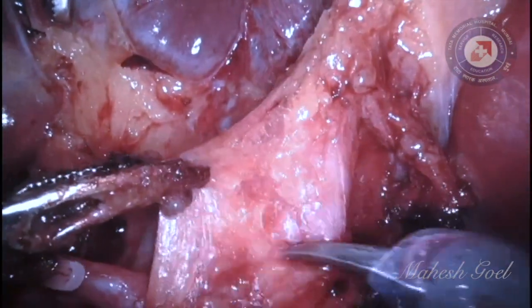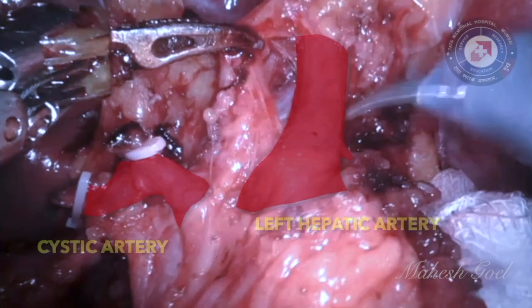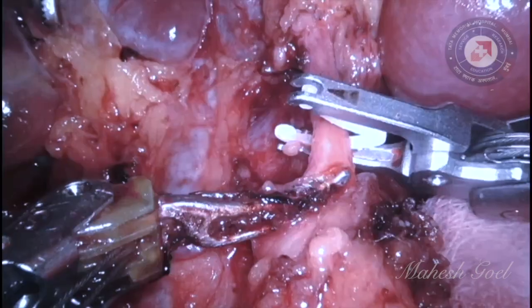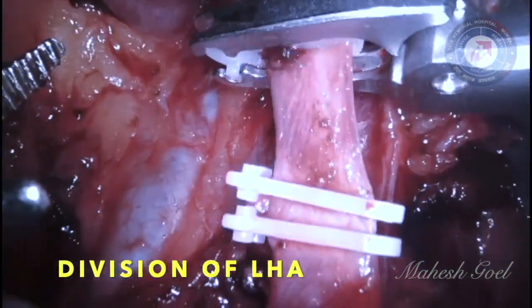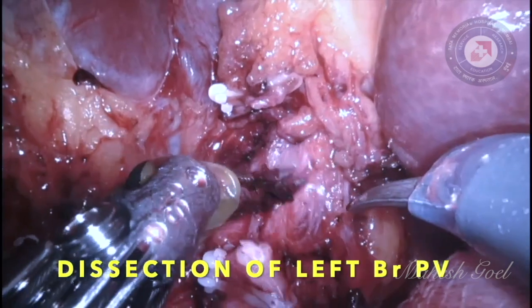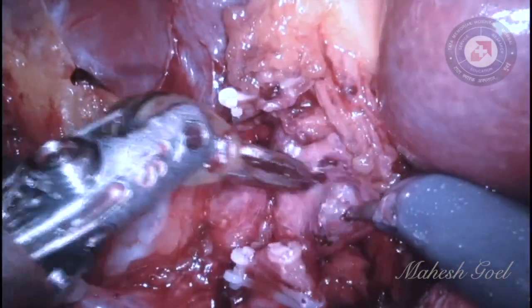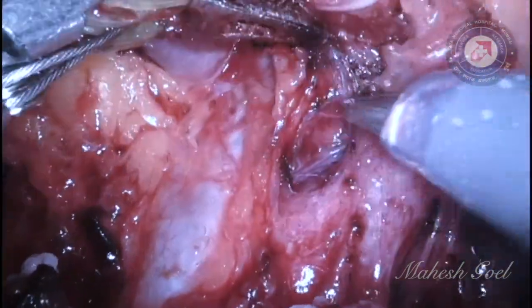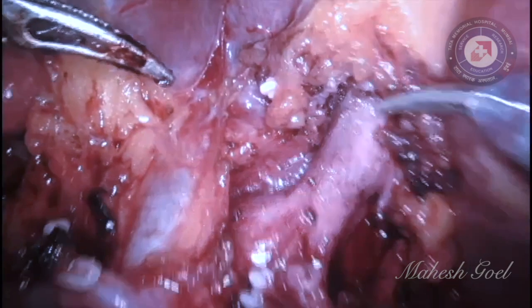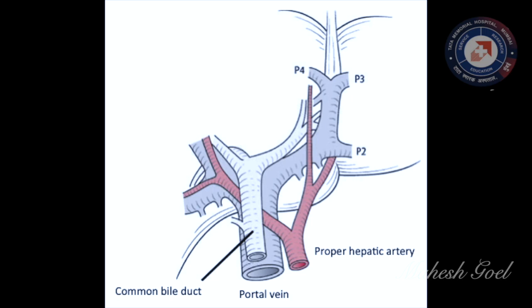We then proceed to dissect and isolate the left portal pedicle. The left hepatic artery, seen here, is dissected out, ligated, and divided. With the division of the left hepatic artery, we see the left branch of the portal vein just behind, which is meticulously dissected for clamping. Depicted here for anatomical relations are the structures delineated so far: the biliary system, the hepatic artery, and the posteriorly placed portal vein, as shown in the diagrammatic representation.